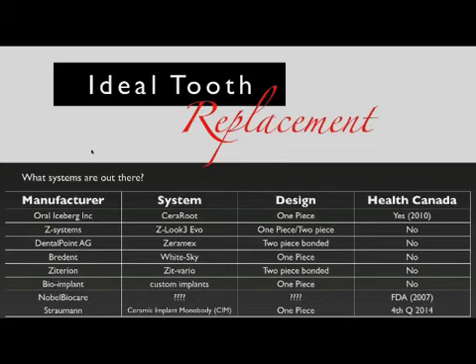and it's, as far as an implant, very similar to what we have with CeraRoot and Z system. Again, a one-piece design that is compatible with the other Straumann instrumentarium. This implant is approved for use in Europe, and I think it's shortly coming to Canada and to the US.